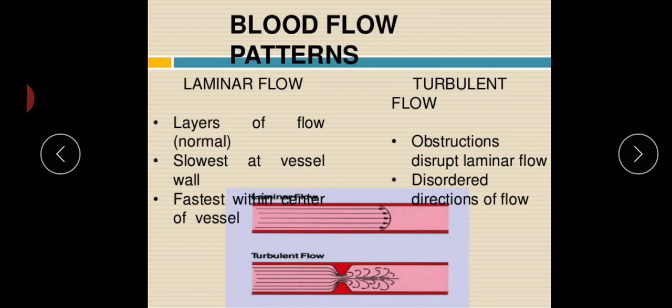So, how is the blood scattered by ultrasound? The composition of the blood causes important differences between the Doppler signal generated by blood and that generated by solid moving structures. Sound reflection from solid structures is usually referred to as specular reflections.